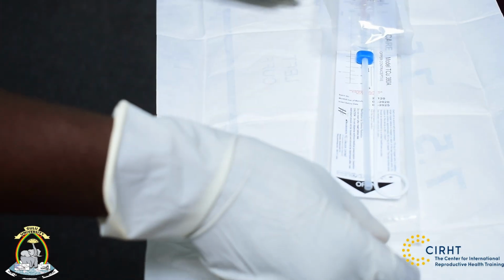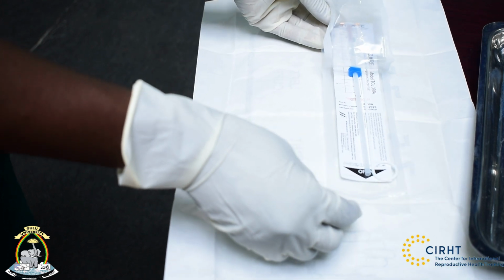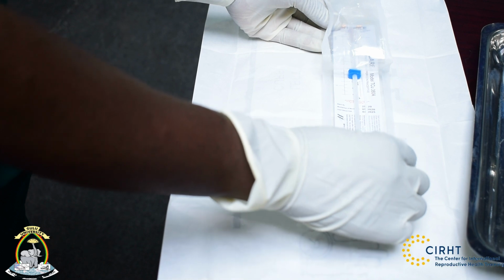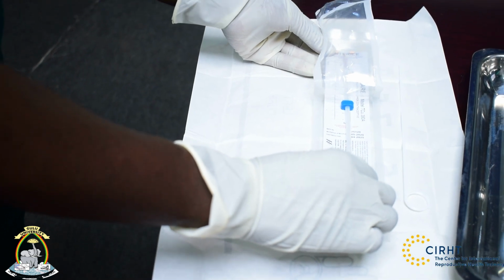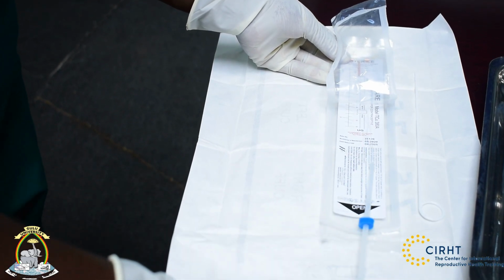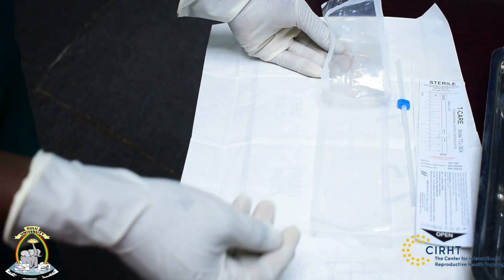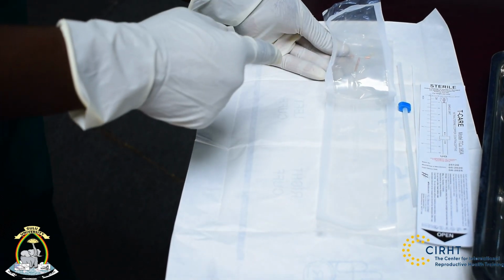So what we are going to do is, with our less dominant hand, we are going to stabilize the IUD so we can remove the plunger and the rod and the card from the packet. So we shall remove the plunger, we put it aside because we do not need it for this procedure. For this procedure, we already said this is instrumental, so we don't need the insertion rods and the plunger here. Also, we shall remove the card so that we're only left with the IUD in the packet. Notice, I am not touching the IUD. My sterilized hands are touching the IUD packet.